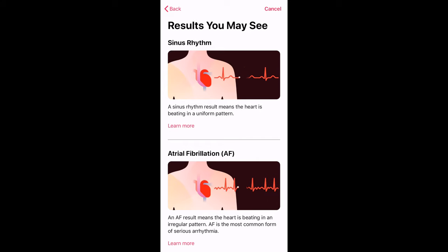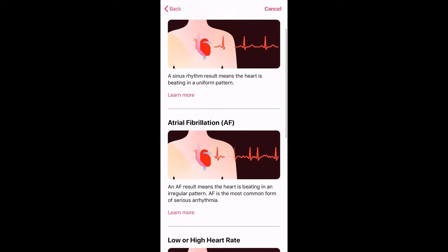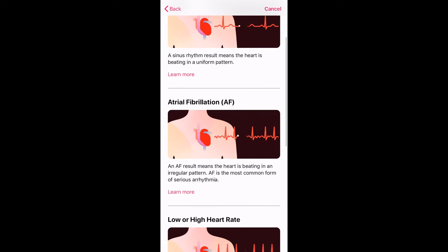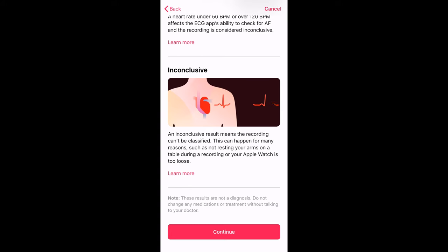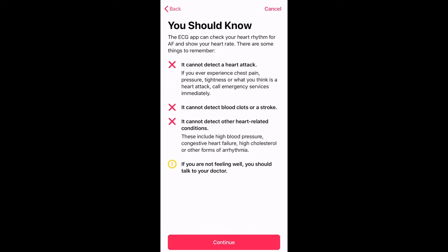The different result types include sinus rhythm, atrial, low or high heart rates, and also inconclusive results. A few things it points out that you should know — one of the main things being that the Apple Watch Series 4 cannot detect if you're having a heart attack.